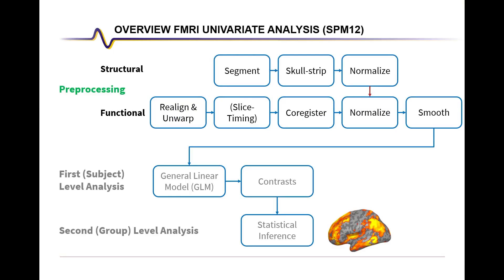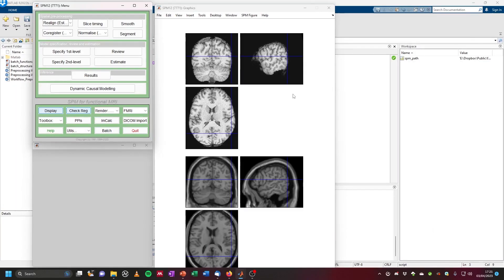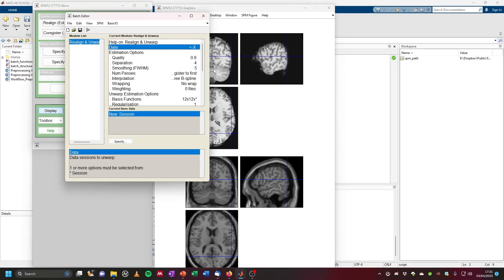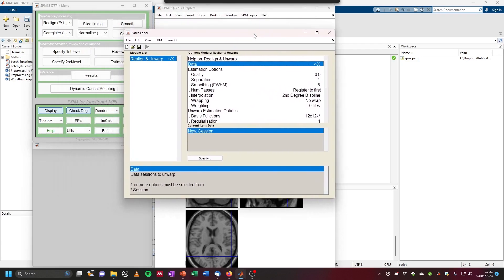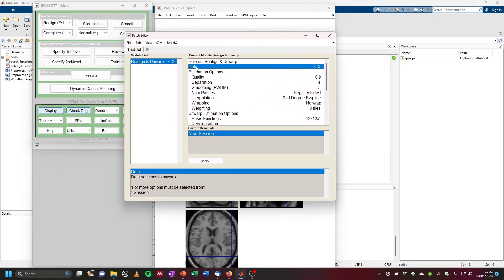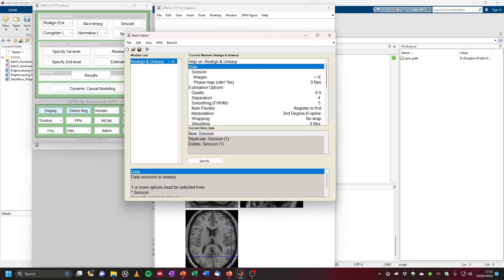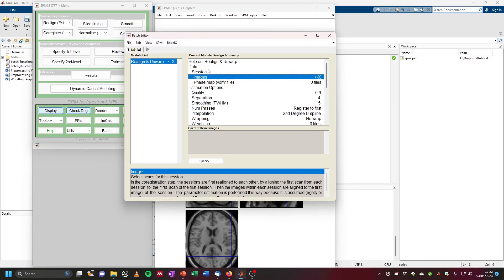Now we can start preprocessing these functional images. Looking at our overview again, we can see that functional preprocessing starts with realignment and unwarping. In SPM, we can click on the top-left 'Realign' and at the bottom select 'Realign and Unwarp'. Click on this, and then under 'Data' click 'New Session' — a session opens with input images.